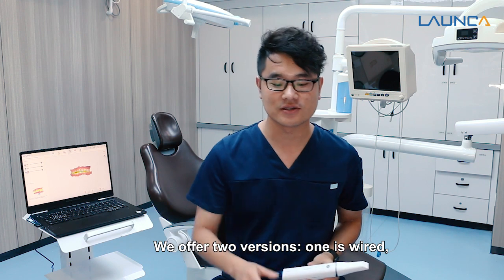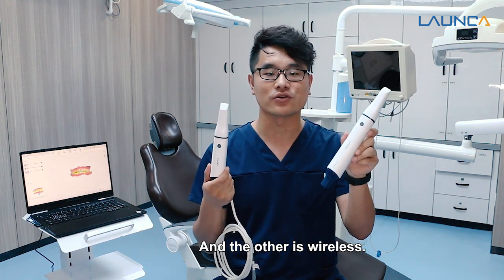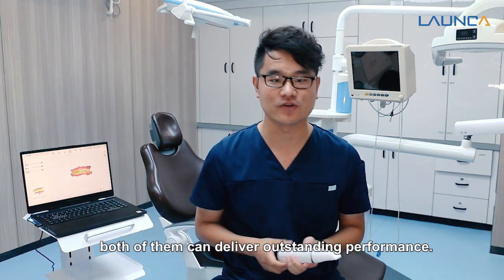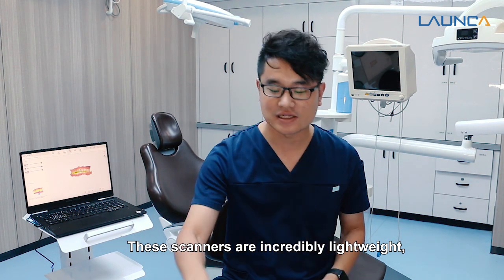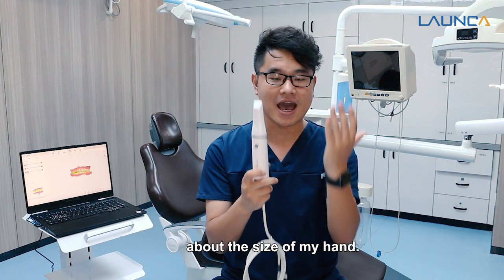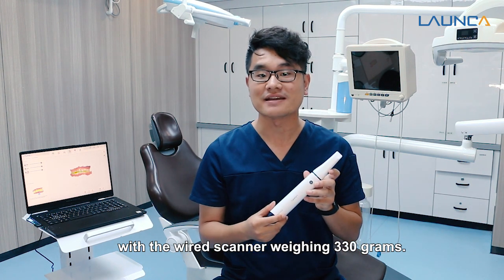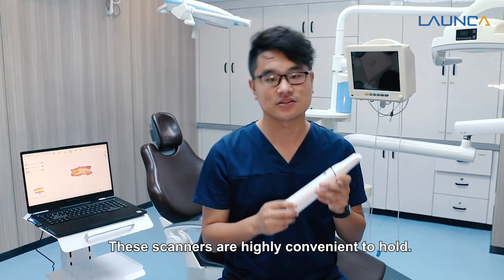We offer two versions: one is wired and the other is wireless. Both of them can deliver outstanding performance. These scanners are incredibly lightweight, with the wireless scanner weighing only 180 grams and the wired scanner weighing 330 grams — about the size of my hand. These scanners are highly convenient to hold.